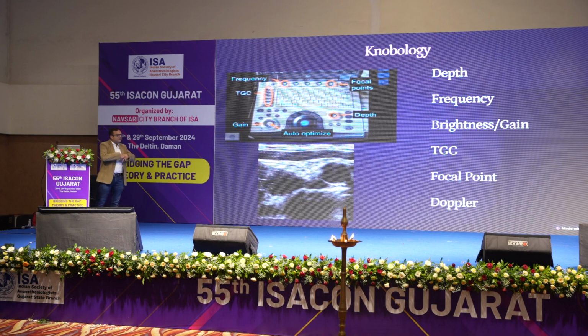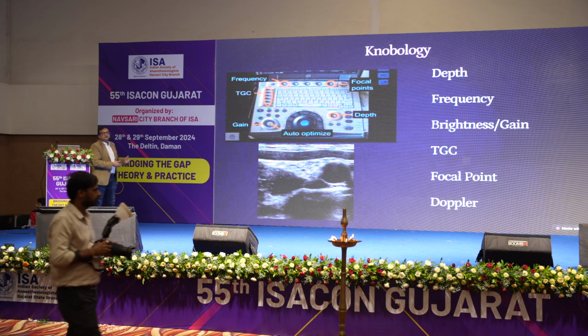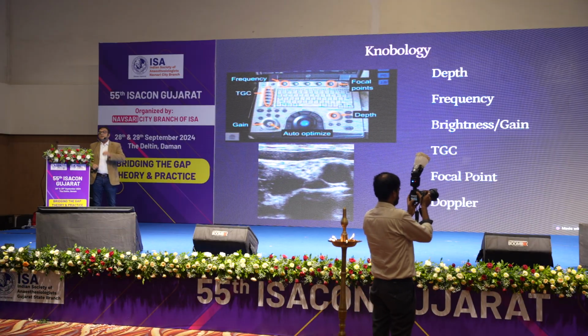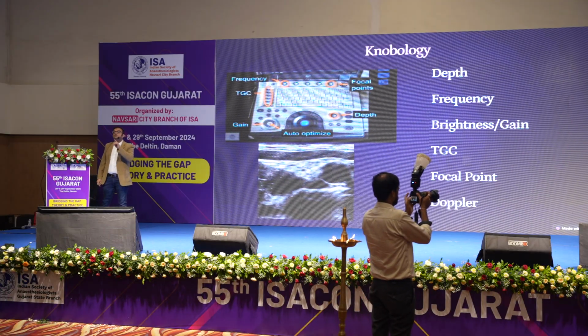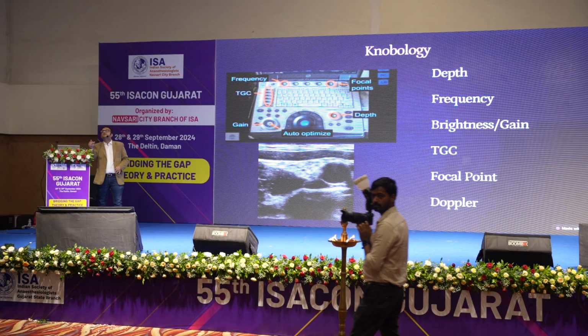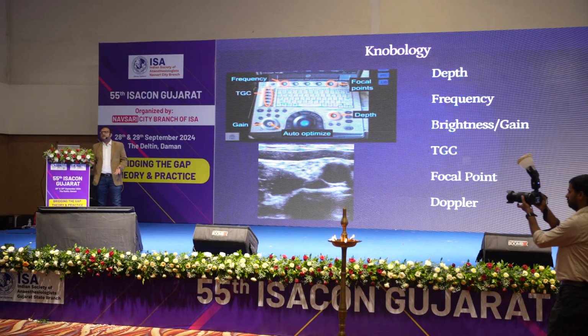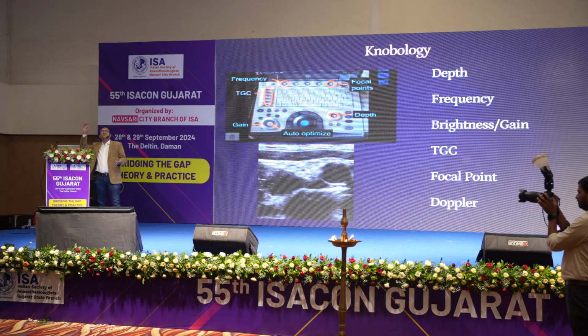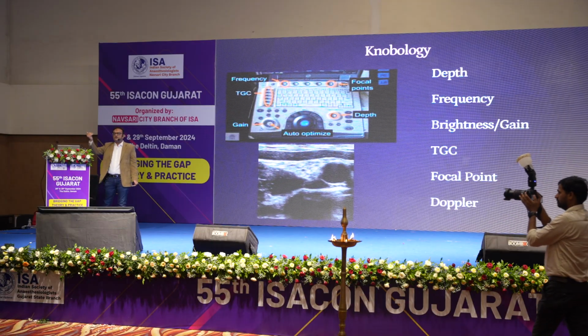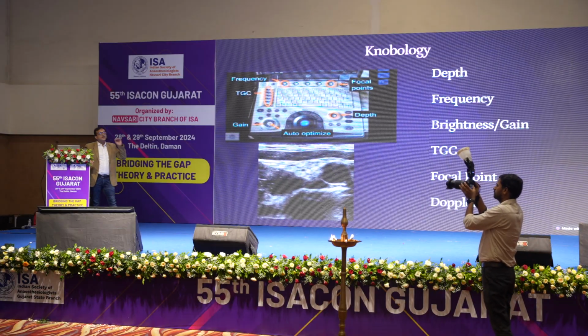Now the important part, there are many switches on your machine. What to select? First is the depth. Before giving any block, you should know at what depth your desired structure is going to be there. And according to that, you have to select your depth in advance. It does not look good if you start at 15 centimeters for a supraclavicular block, and then decrease to 3 to 4 centimeters. So you should know at what depth your desired structure is going to be.